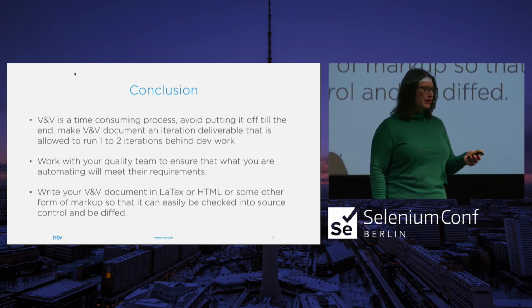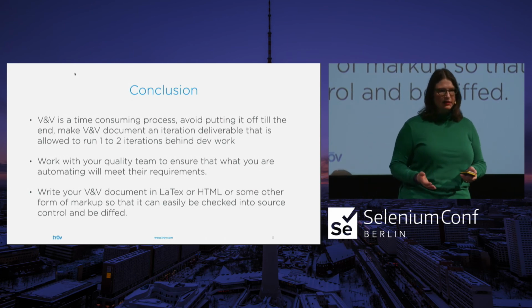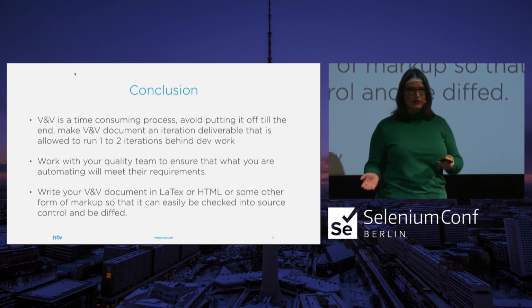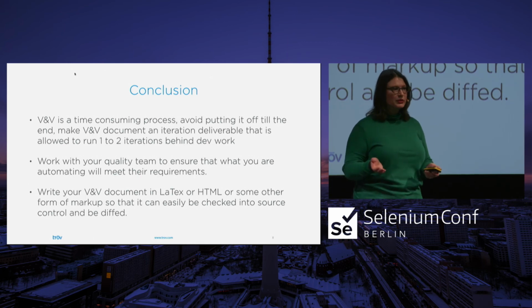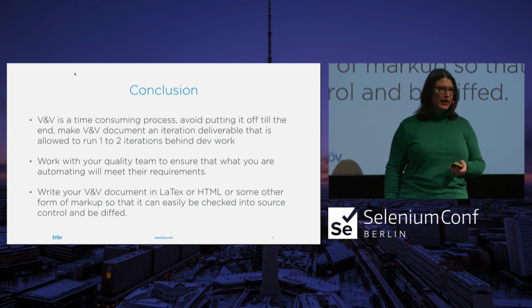So how we dealt with that with our automated testing tool, because it's difficult to validate a testing tool, is we showed that we were able to run our automated tests and our manual tests using the same steps and produce the same outcome. So it wasn't doing anything funny behind the scenes. And that was how we managed to make that work.